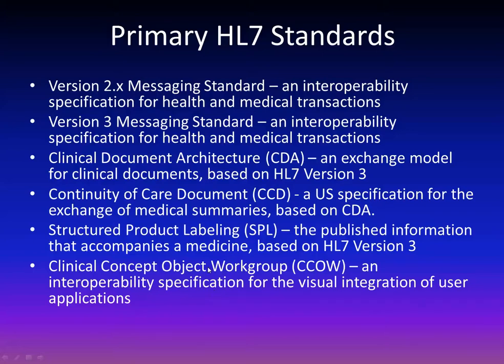So when we hear HL7 interface, these are some of the actual details of what that interface, or that HL7 connection, actually means.